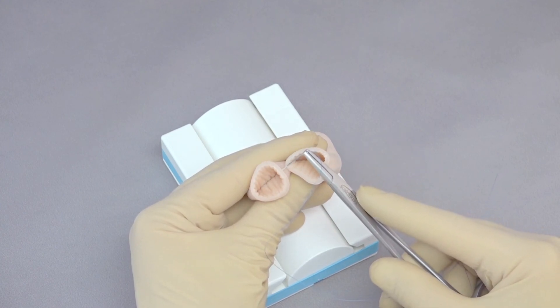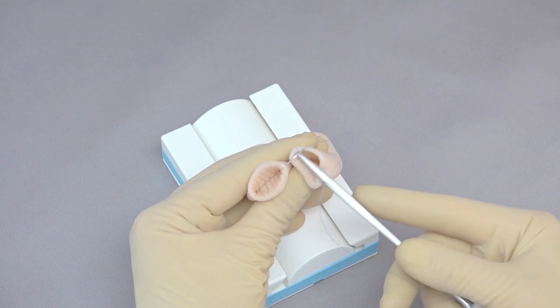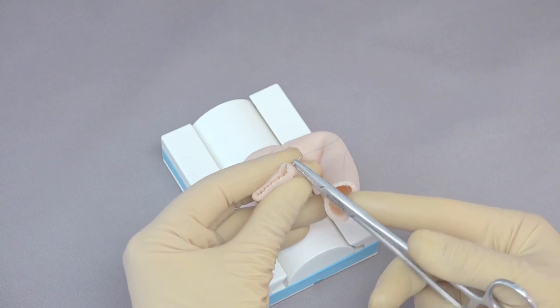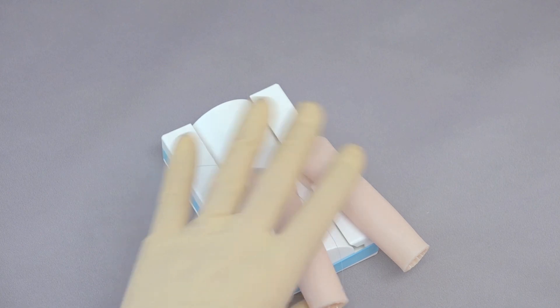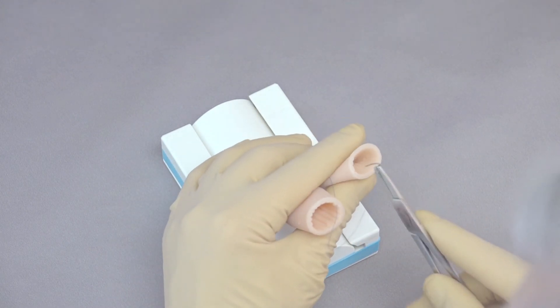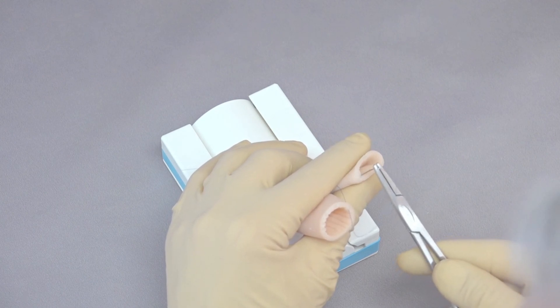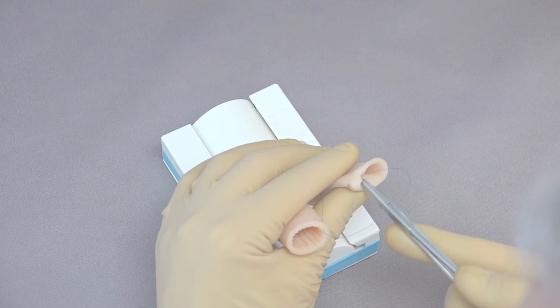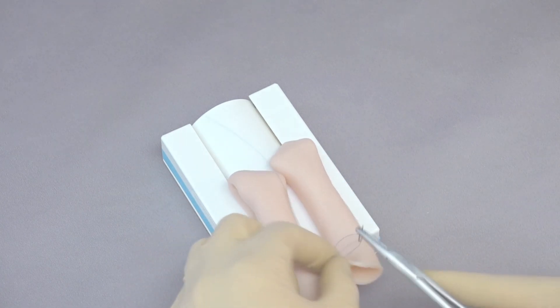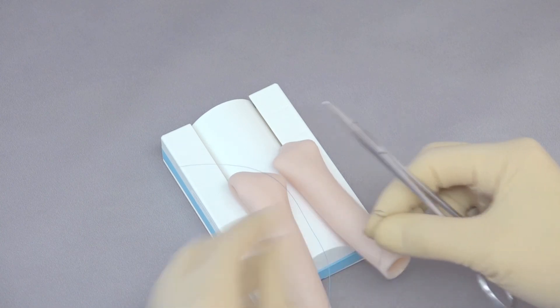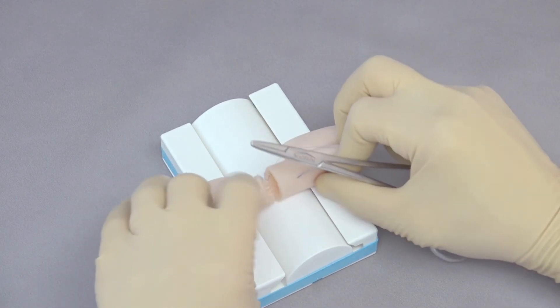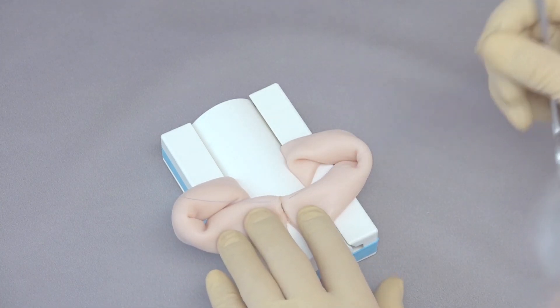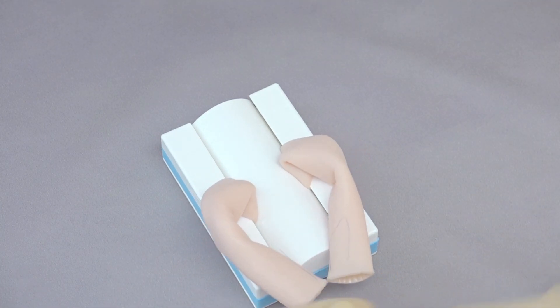I'm going to take the first suture bite on the mesenteric surface and you can come in and just miss the mucosa so you're not doing a complete thickness suture line. I'm coming from the outside to the inside. I'm going to pull down through that and then I'm going to line this up on the other side. Again I'm just missing the mucosa but I'm going to get the submucosa which is the holding layer. So from the lumen to the outside. I can tighten this up so I can position these so that these loops are facing each other.